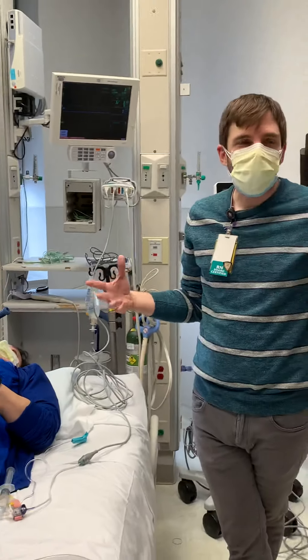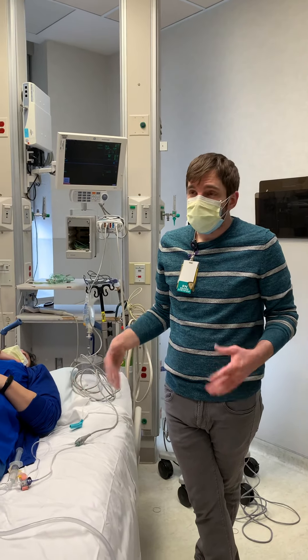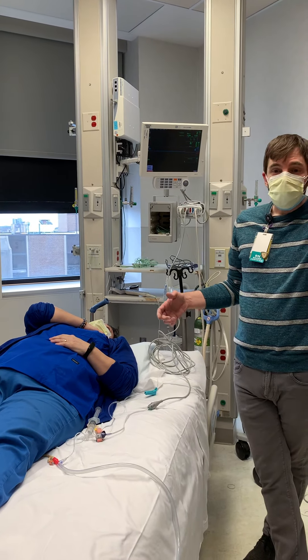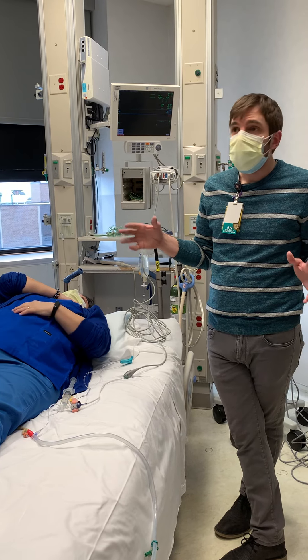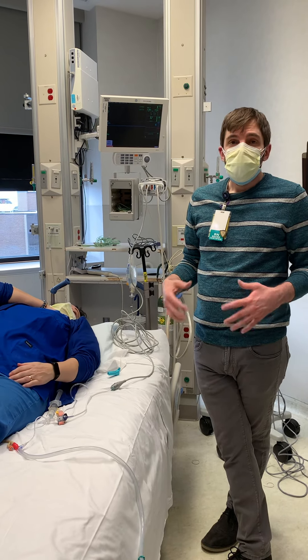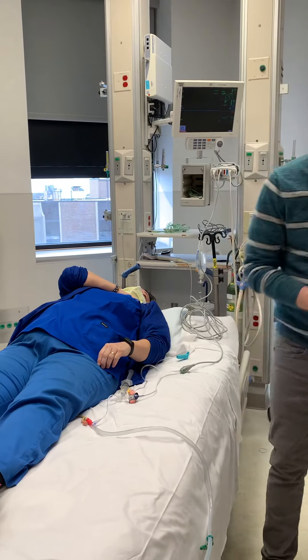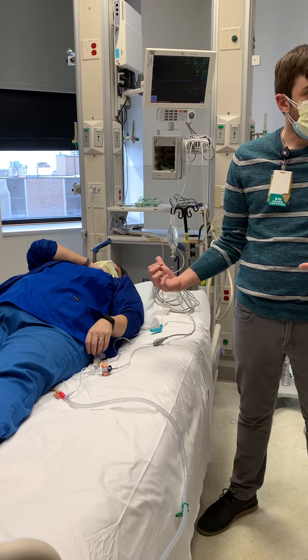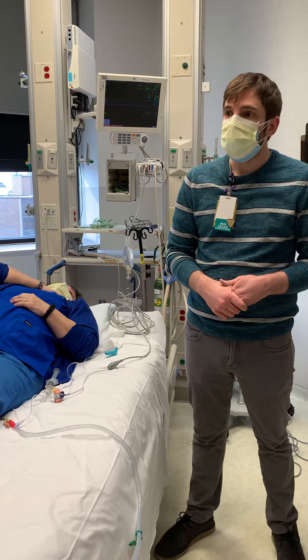It's going to start out saying something like 80 or 100 — we know no patient has a bladder pressure that high. When it plateaus out, it's probably going to be 15 to 20. If it's really high it might be 25 or 30 if they're very distended. That's the number you take. Once you get your number, release — that fluid goes back down into the Foley bag. Just remember to subtract those 25cc's from your urine output for that hour.